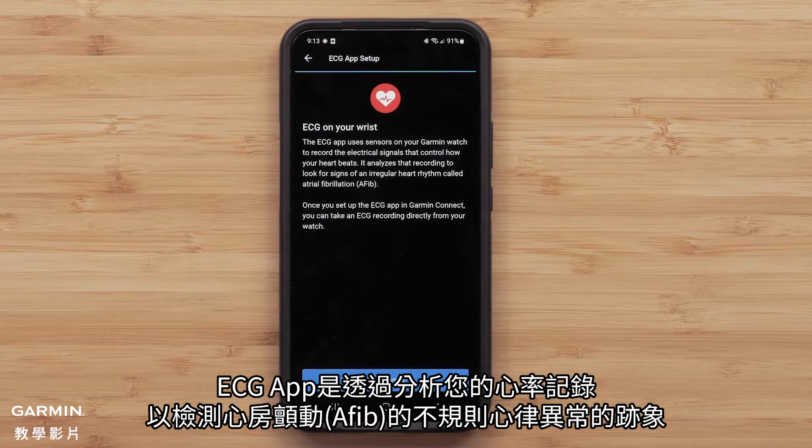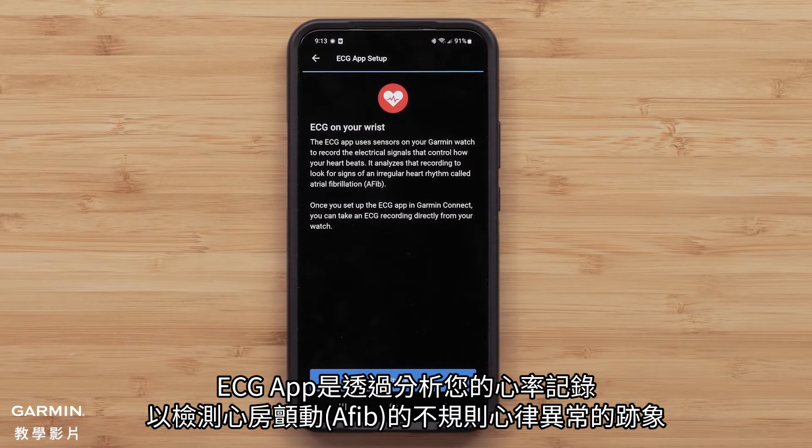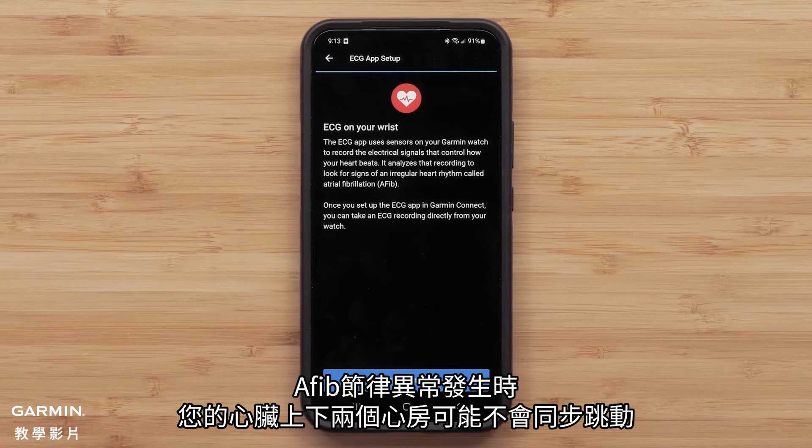The ECG app analyzes your heart rate recording to detect signs of an irregular heart rhythm called atrial fibrillation, or AFib. AFib rhythms occur when the upper and lower chambers of your heart are not beating in sync.